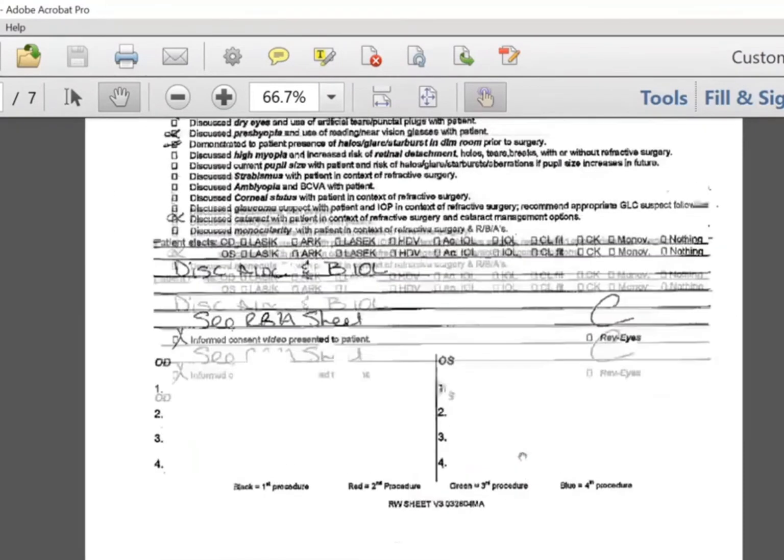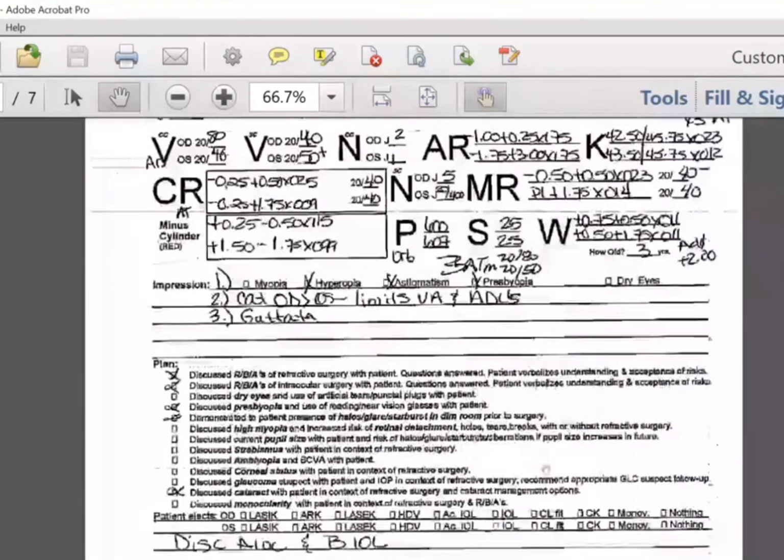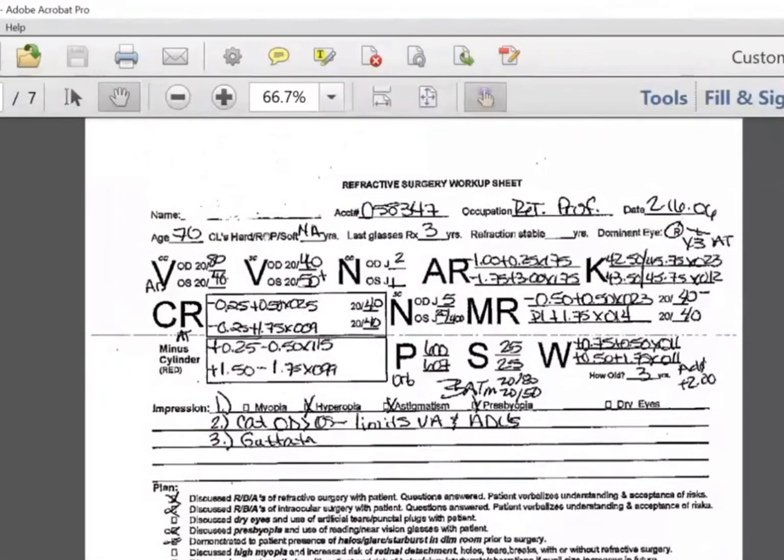I think I didn't show you this earlier on, but visual acuity can be represented in this form in the patient's chart. So you can see the right eye and the left eye: the visual acuity is 20/80 for the right eye, 20/40 on the left eye. So obviously, the right eye has a little bit more problems.